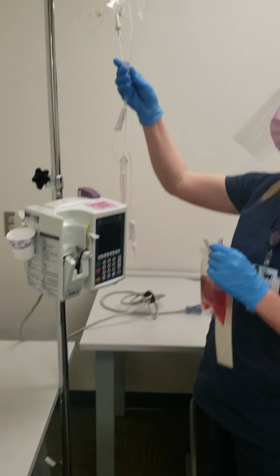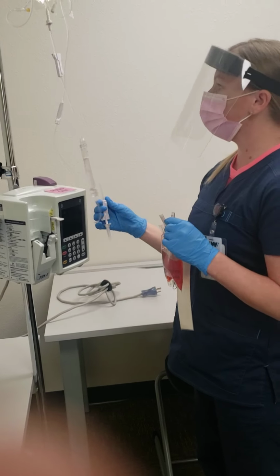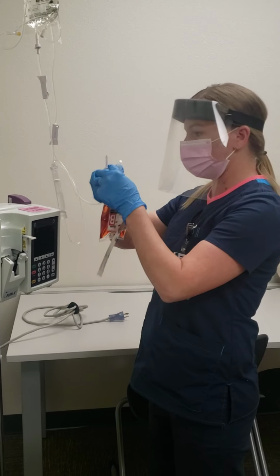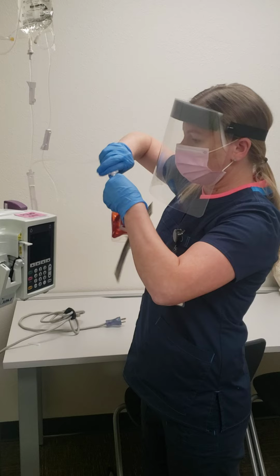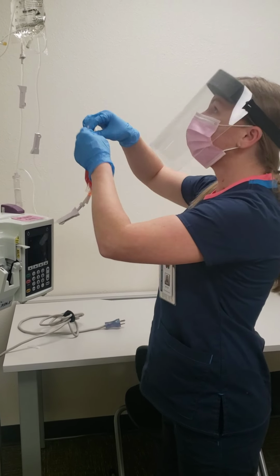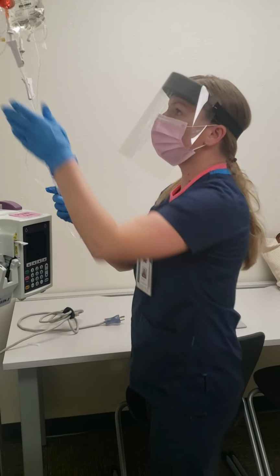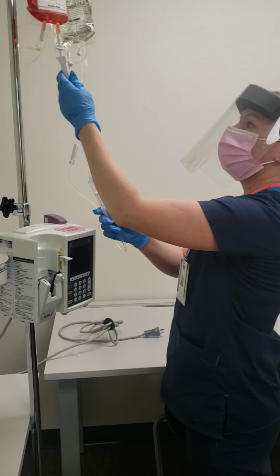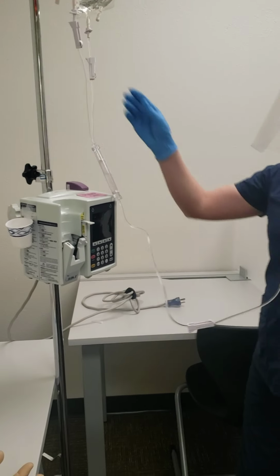So I want to make sure that all of these are closed. Okay, perfection. Okay, and I'm just going to go ahead and spike this bag. Okay, so I want to just double check again that my normal saline is closed. And I'll go ahead and open this clamp.